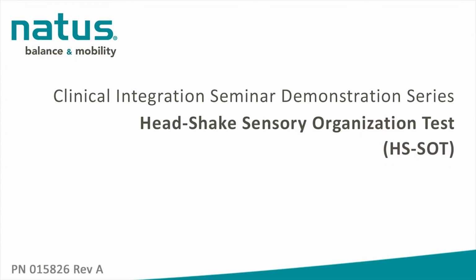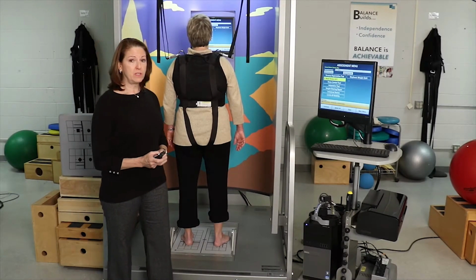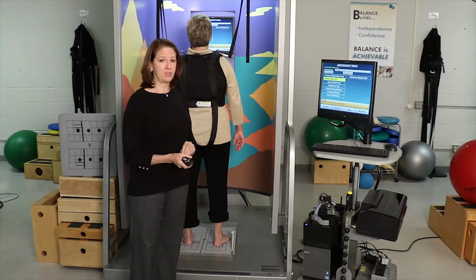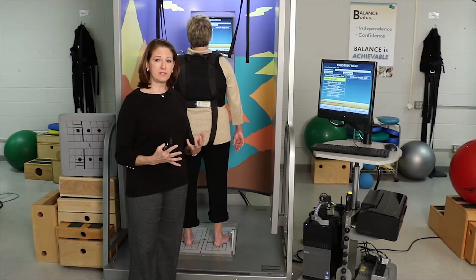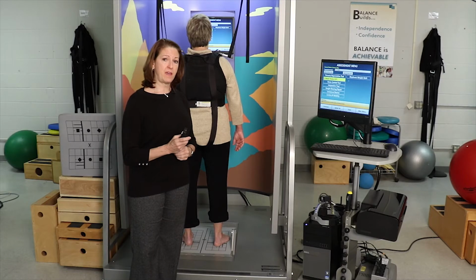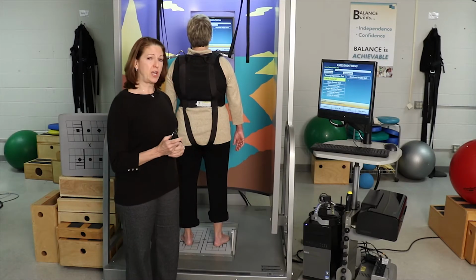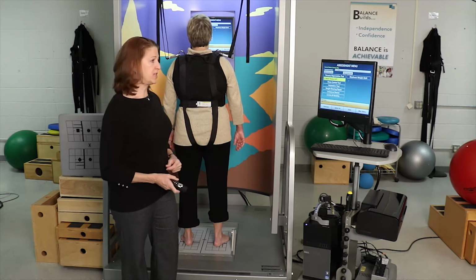Today we're going to be demonstrating the head shake sensory organization test. We have a 58-year-old female who has a normal SOT, sensory organization test score, but is still symptomatic on conditions 5 and 6. She's complaining of a little bit of nausea and dizziness. So we want to bump up the sensitivity of the test and add a head shake to the SOT to see how she performs under a higher demand condition.